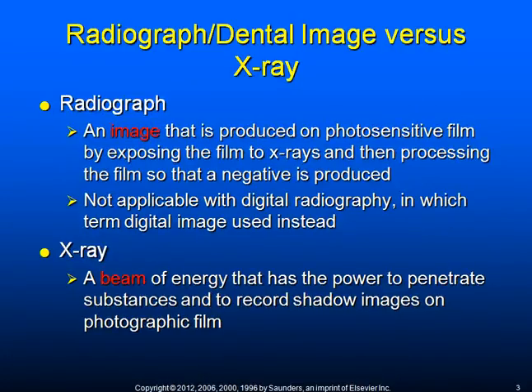The terms radiograph and X-ray are often used interchangeably, but it is important to know that they do have distinct and different meanings. A radiograph is the actual film that has been exposed, and an X-ray refers to the beam of energy or radiation.